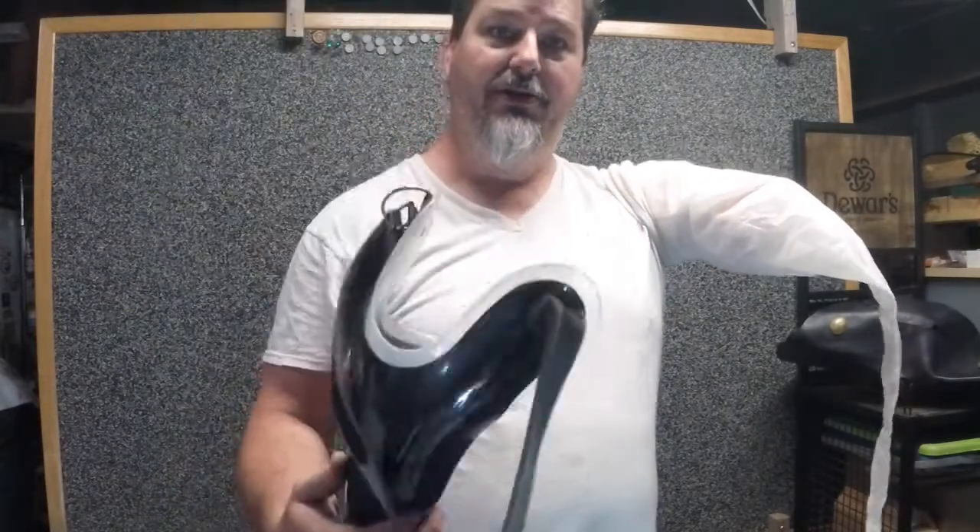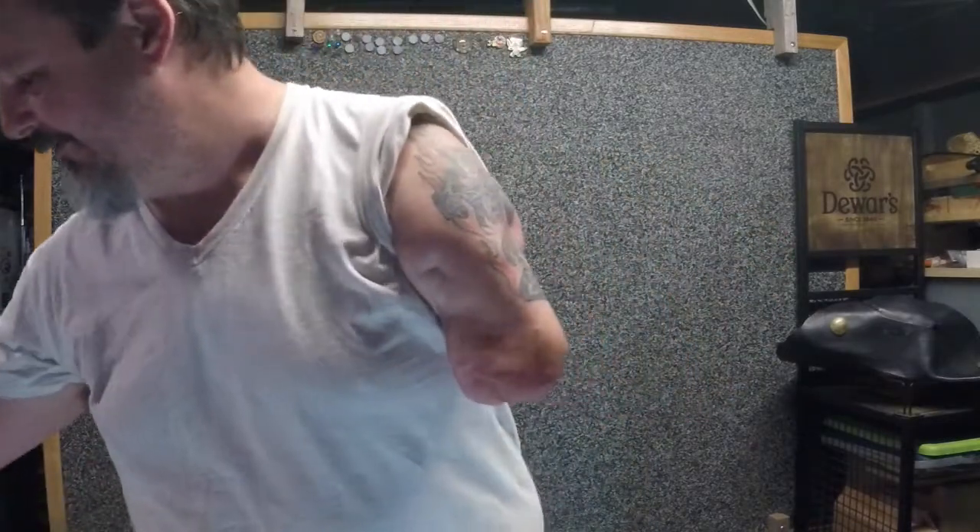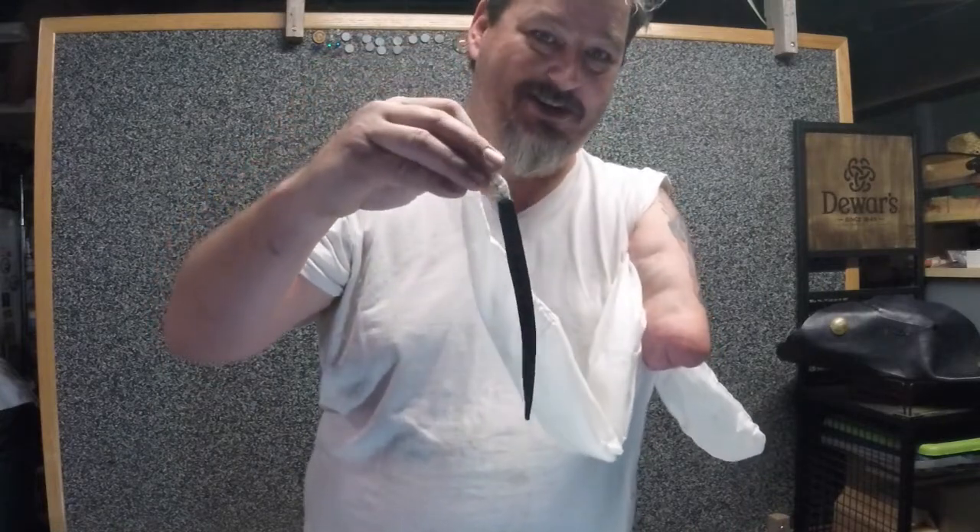First I'm going to show you something on my pull sock that you might want to talk to your prosthetist about. There's no way for me to stick my arm down into my socket and get this through that hole without some kind of tether at the end. You want to make sure you get this tether because otherwise you're going to be really frustrated trying to put your arm on.